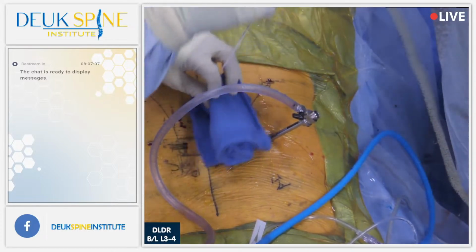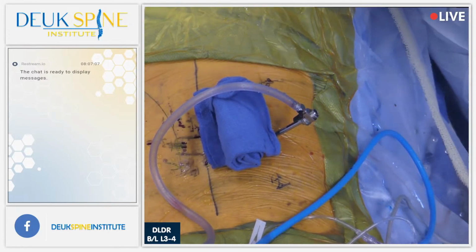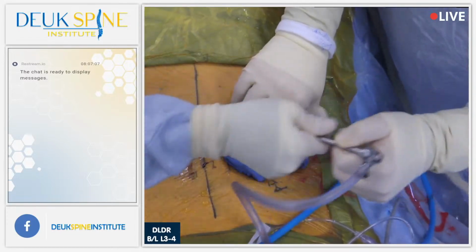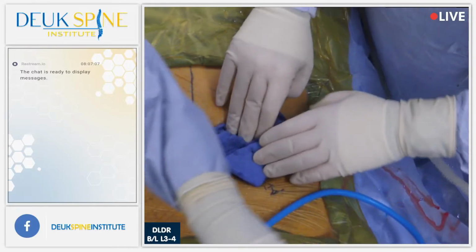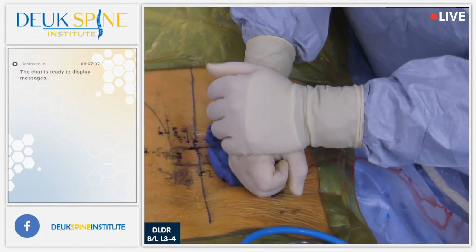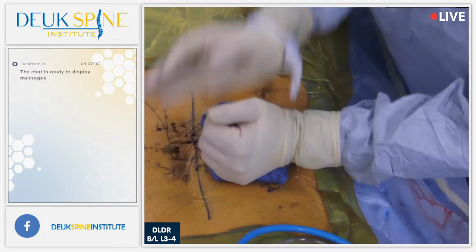Great questions. Any more questions people have? Yes, we have another question from Siva on YouTube. All right, Siva's on fire today. They ask, would the procedure treat central canal stenosis while removing the affected disc at the same level? Yes. The procedure can also treat central canal stenosis.